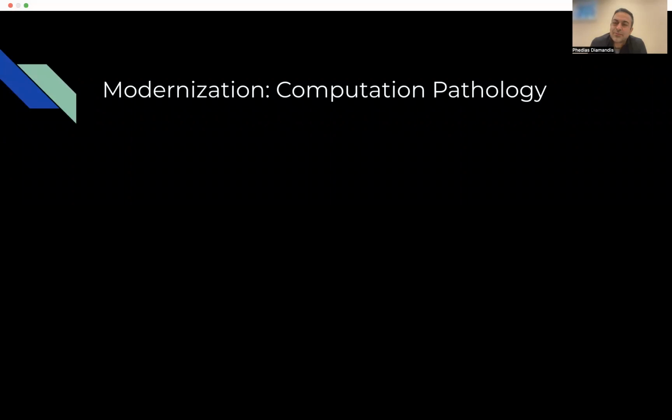Now, again, just to briefly end, this is not going to be a thorough discussion, as we have other lectures on NeuroPsyQ that cover computational pathology basics, and we'll make many more. But really, the key thing to understand is, why am I sitting through a lecture on an H&E stain in 2022? And the reason for that is that, aside from the powerful aspect of it, even in the hands of an experienced pathologist, there's been an emerging and explosive interest in the H&E stain, because it's been amenable to modern innovations in computer vision, such as deep learning.